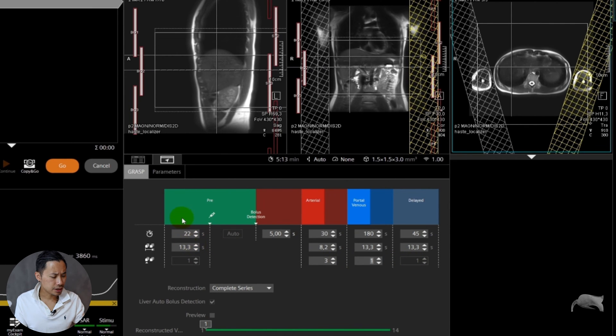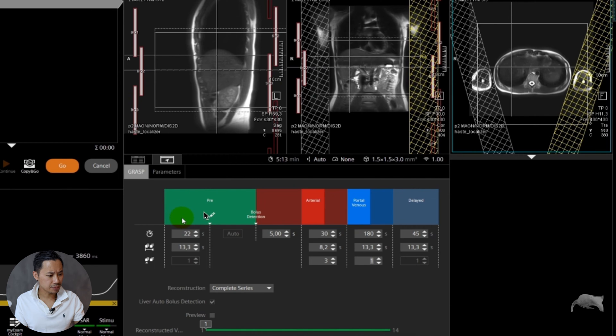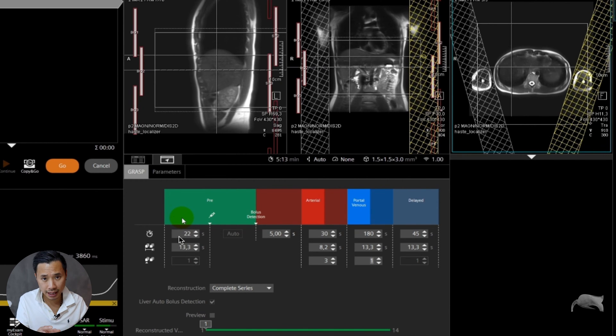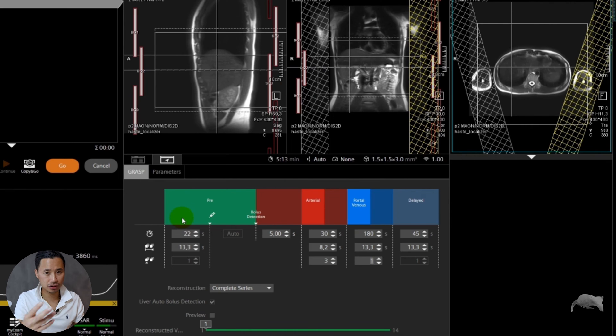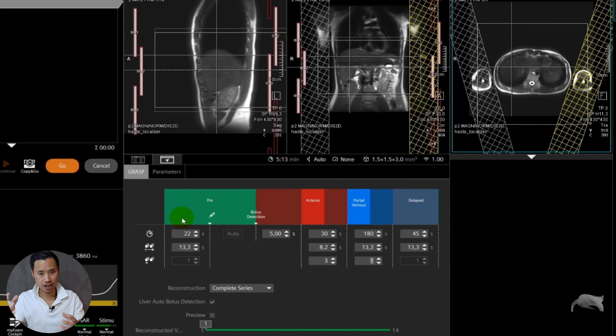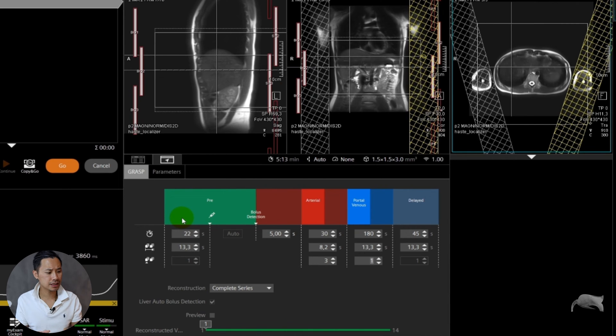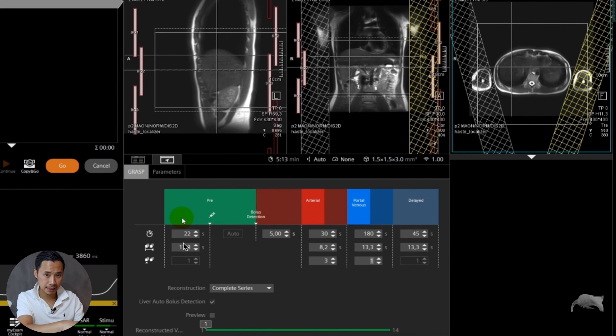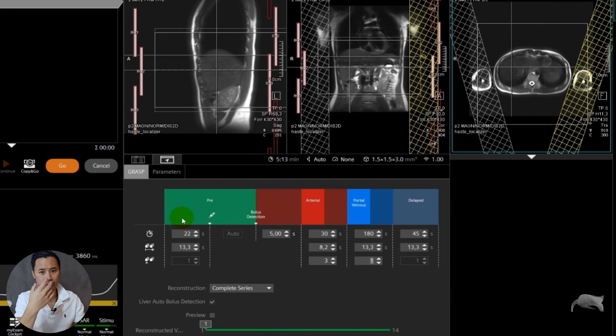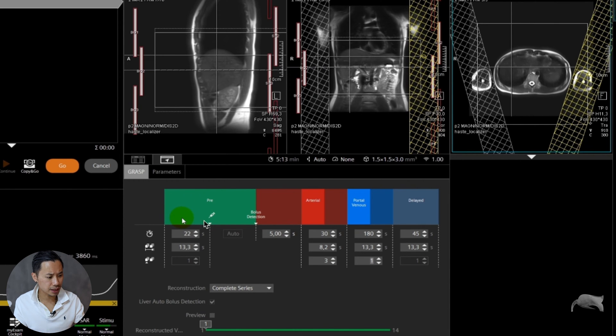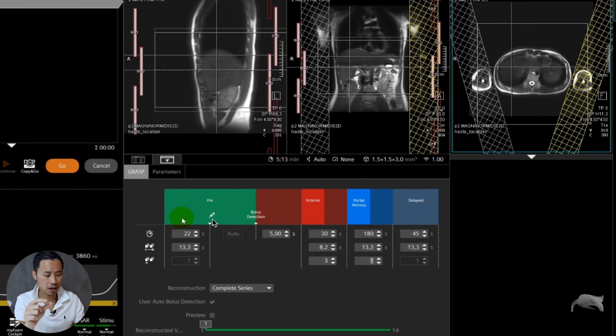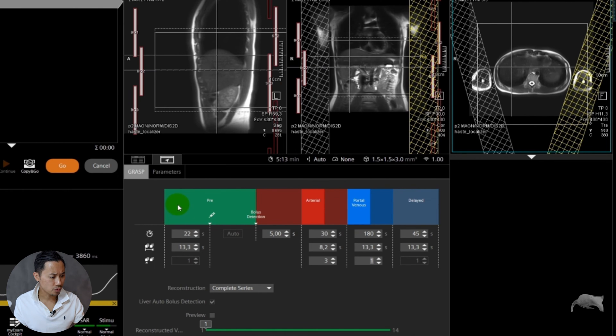You can see in the pre-images right here, before you inject the contrast, it takes around 22 seconds. This 22 seconds can change, sometimes it can be 18 seconds or 20 seconds, but it doesn't matter because you don't need to do any calculations. Very easy to use the sequence. Just notice whenever you start the sequence, it will have a countdown from 22 to zero. Whenever it reaches zero, it means it's already done the pre-images and it says to you inject contrast.